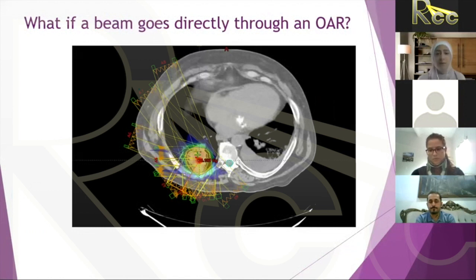There's another case. I was looking at our patient database, looking for intriguing things to present, not to do. And I found another interesting case here. As you can see, this looks like 11 beams. You cannot see the 11 beams, but this is, I think, 11 beams, also lung.